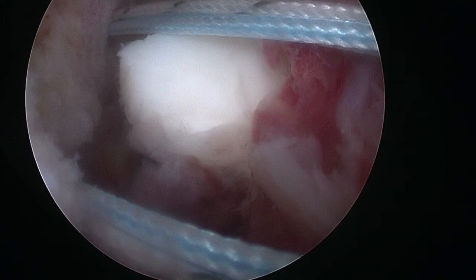A 3mm double-loaded anchor is placed through the anterior inferior portal in the lower part of the glenoid neck. A second anchor is placed in the same way but higher than the previous one.